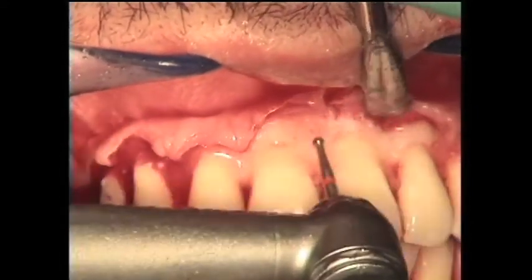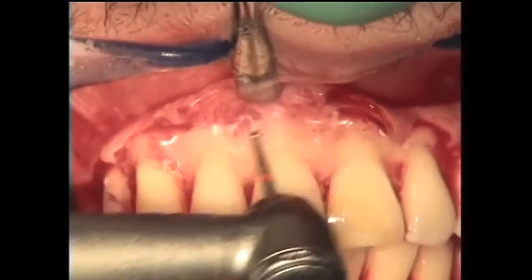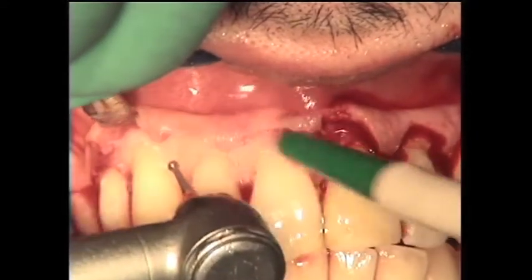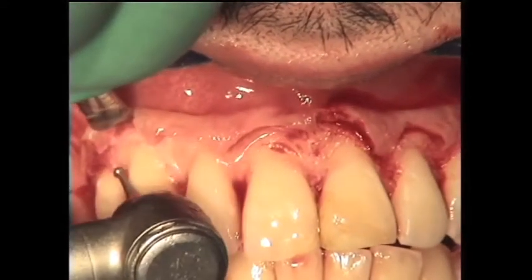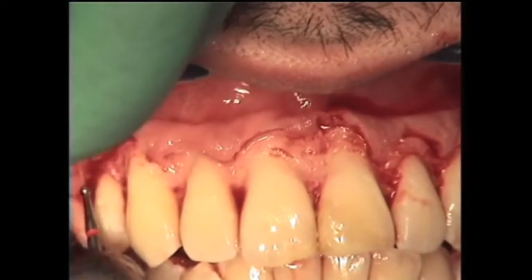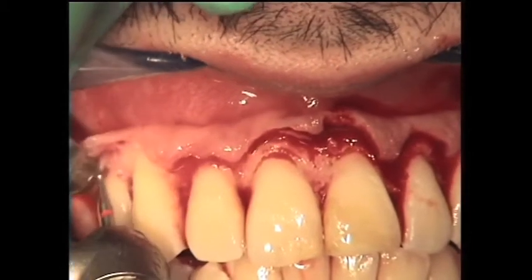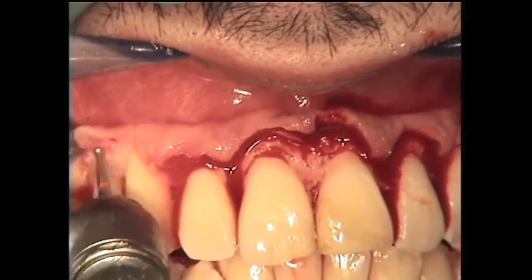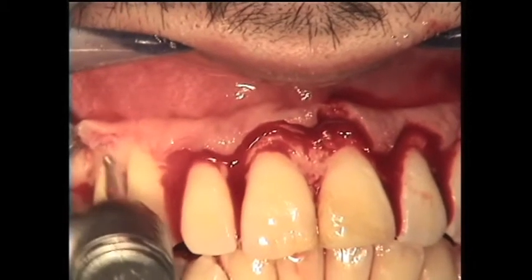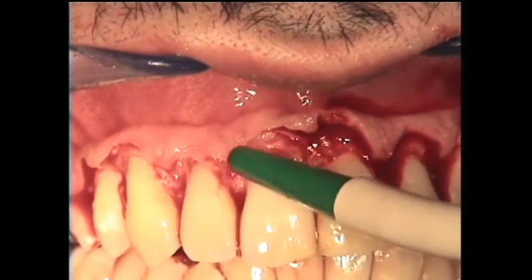The movement of the burr, as you can see, is very gentle and delicate. We thin the bone in the buccal aspect, creating nice scalloped anatomy, and paying attention to repositioning the gingiva in the most passive way possible. The sutures at the end have just to keep the flap in place without any kind of tension.